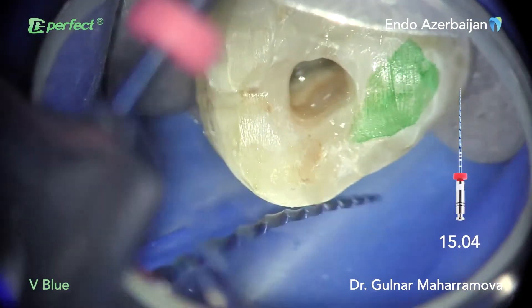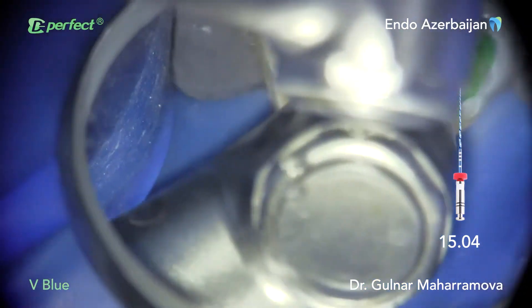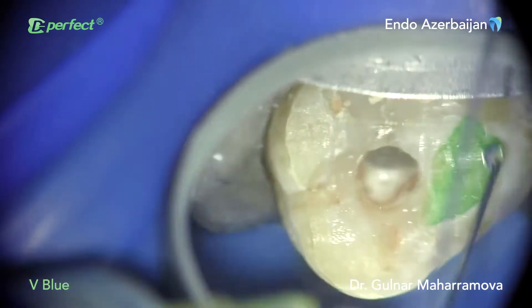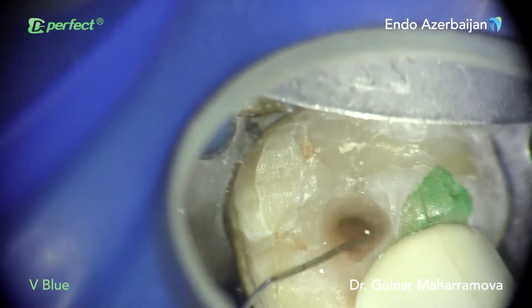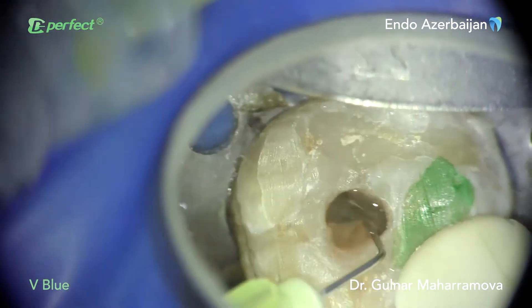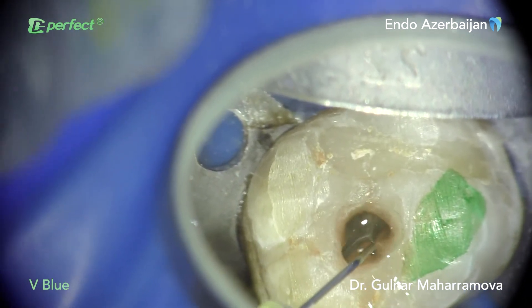There is one crucial property of VBlue files: reduced shape memory. This property was extremely helpful since it allowed me to pre-curve rotary files 15.04, 20.04, and 25.04 before placing them in the orifice of the MB2 canal.